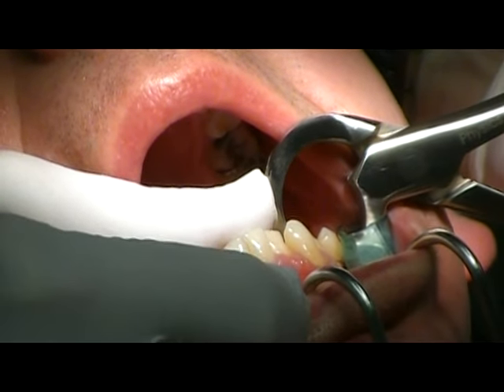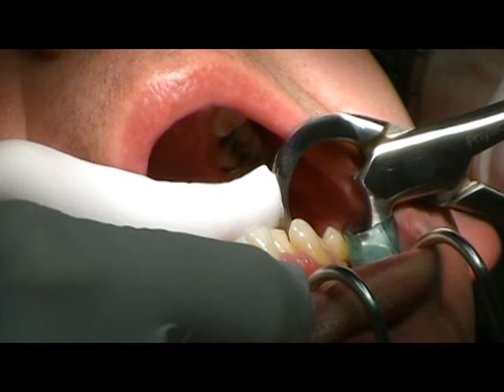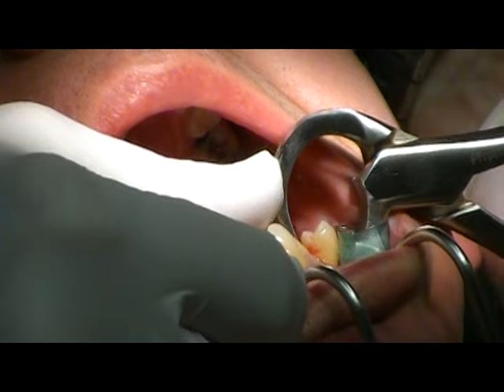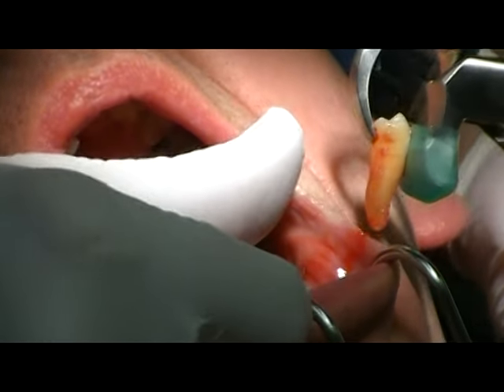Tooth is starting to give, starting to give — watch it, watch it, watch it. Wow. Magic.